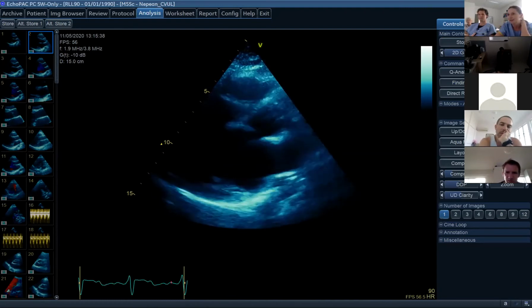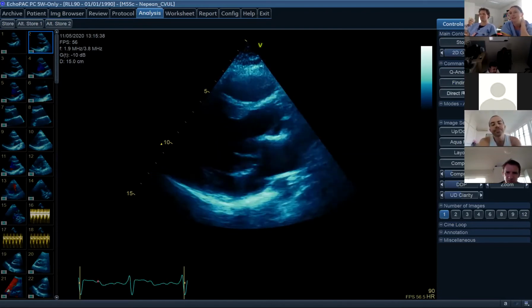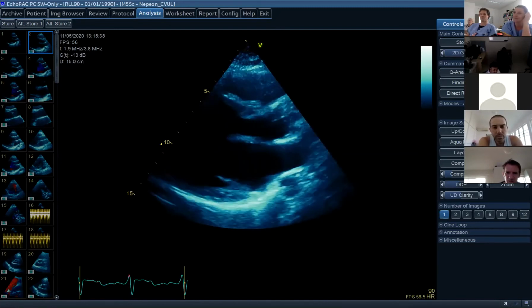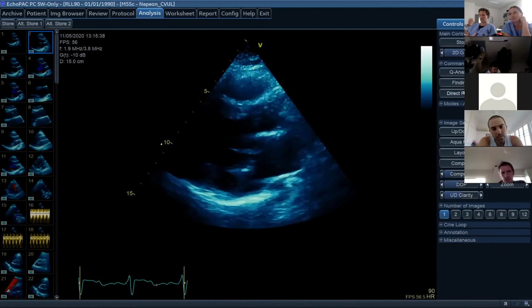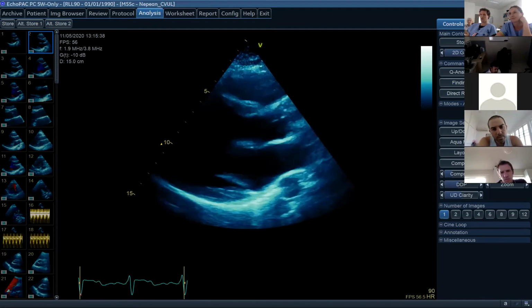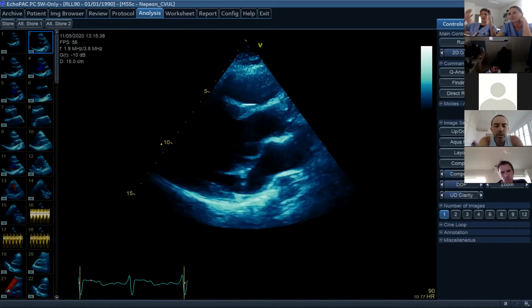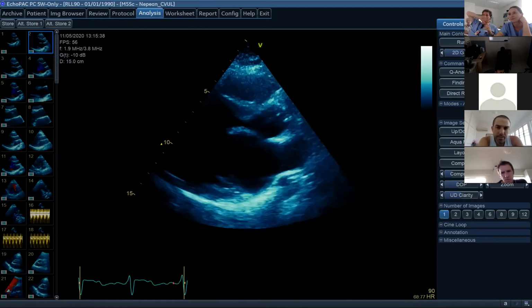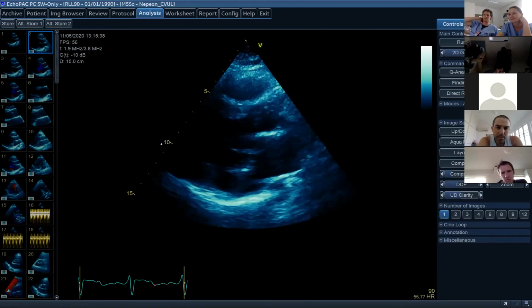Just give us a little bit more on that. So you're absolutely right. You said it looks floppy and thickened. What do you mean by floppy? So it looks like when they are coapting, maybe there might be a bit of collapse. That's bowing as well. Nice. Yeah, what's the bowing? Take us through more of that.